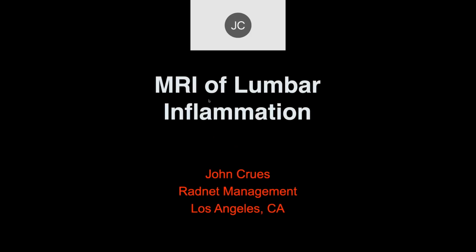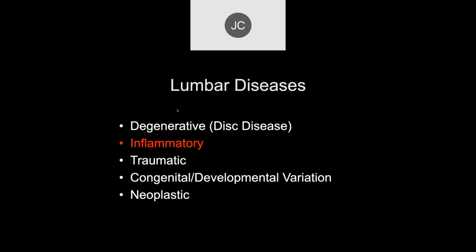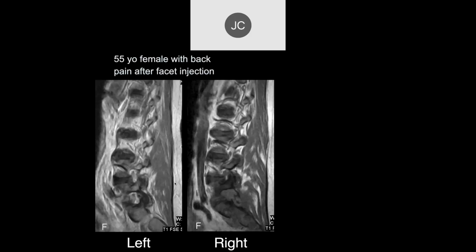Okay, so let's talk about inflammatory disease of the lumbar spine. We've already talked about degenerative disease before. We'll talk about inflammatory disease, and we go on to traumatic and congenital. And I don't think we'll have time for neoplastic, but we'll see.